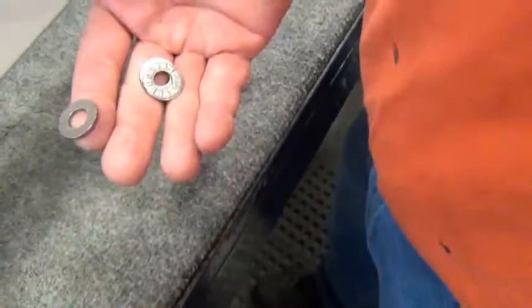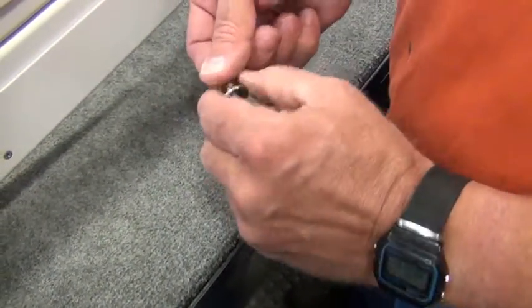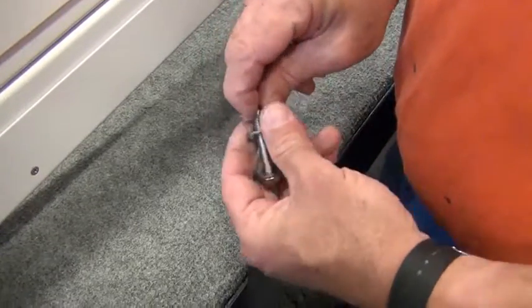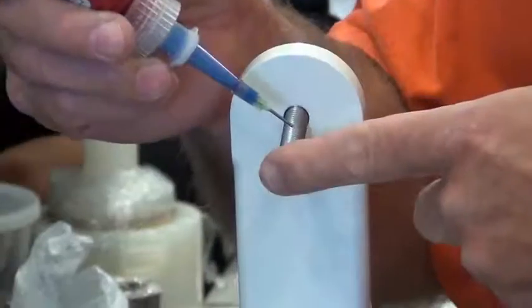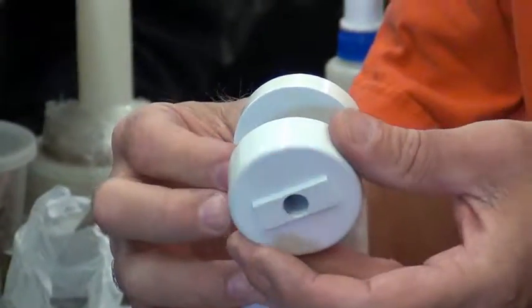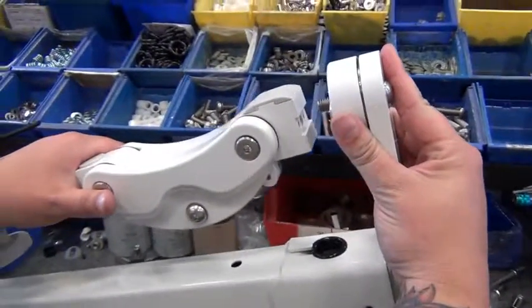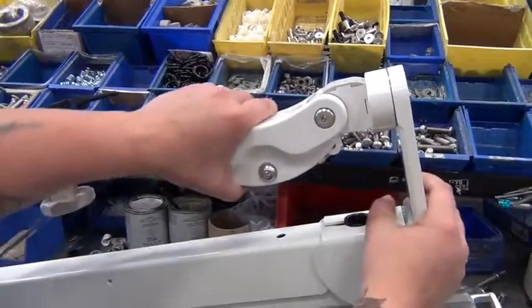Slide a 3/8 inch race, needle bearing, and second race over the 3/8-16 by 1 3/4 button head socket cap stainless steel bolt. Slide bolt through the hole in the foot. Apply blue Loctite. Slide bearing adapter over bolt. Attach Paralink. Torque to 120 inch-pounds. The Paralink should rotate when using a firm grip.